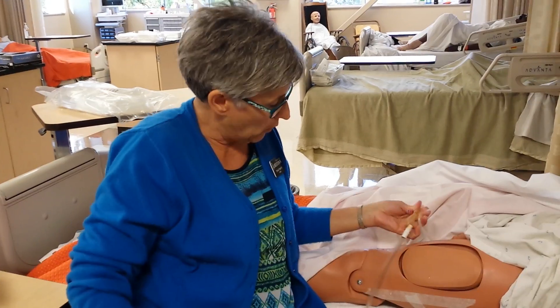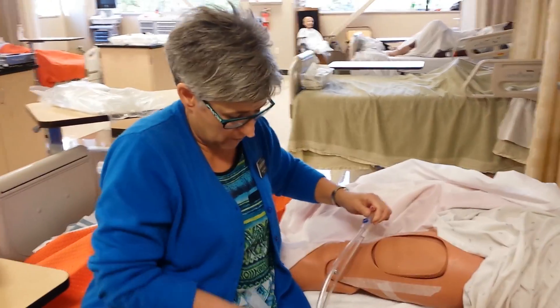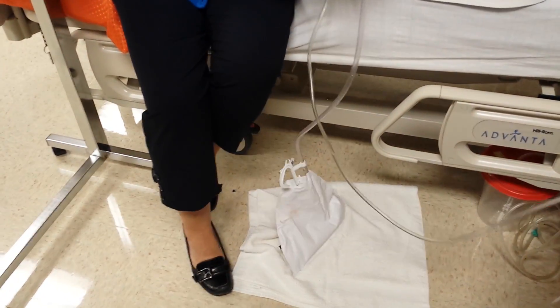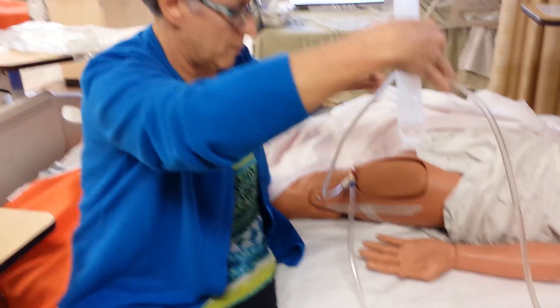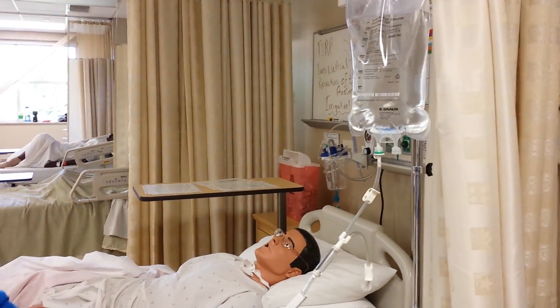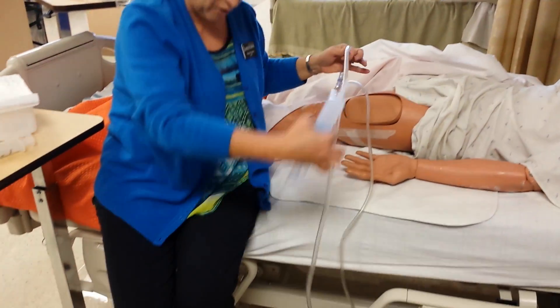I'm going to hook up my flow again. To be clear, you flushed through where the bag goes in — that goes down to the bag. Now I'm going to open back up my drainage, so I don't leave without opening up my CBI. Now look — I've got cherry pink coming out. We fixed him.